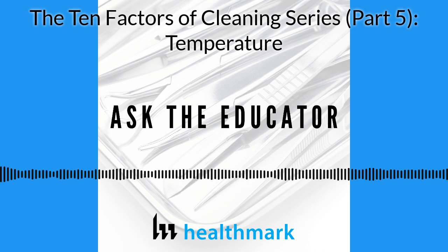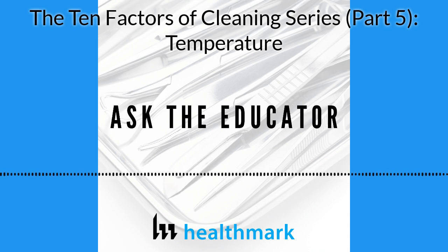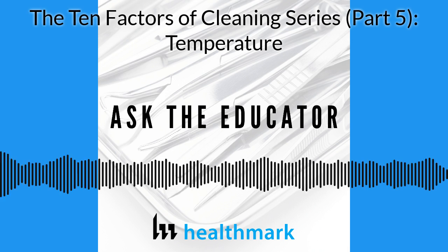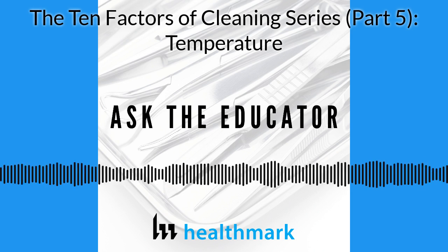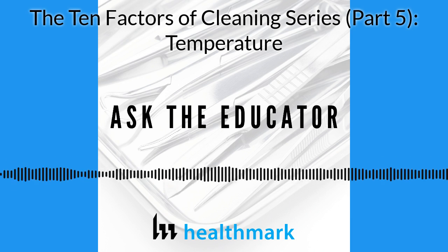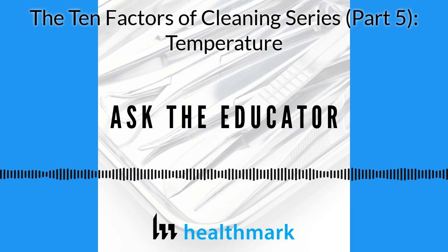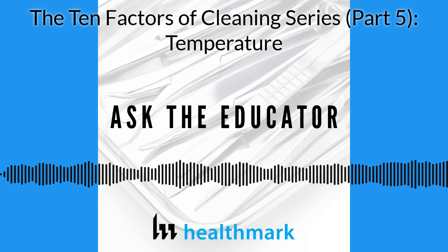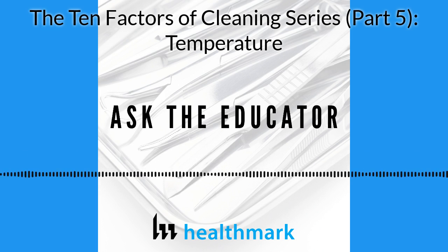You as a manager know that if Joint Commission or another auditing service came in, they actually asked you, what is the temperature of your manual cleaning bath? Why is that important? They wanted to make sure you were using it correctly so it cleaned the best it could. And that could be a simple monitor on the back wall of your sink, or some of them have dosing machines. I think you had one in your department that dosed and put a temperature, right, Kevin? Yeah, because we used a surfactant detergent, it did do the dosing, but we did not have a temperature monitor, only because the IFU did not require a temperature monitor for that.